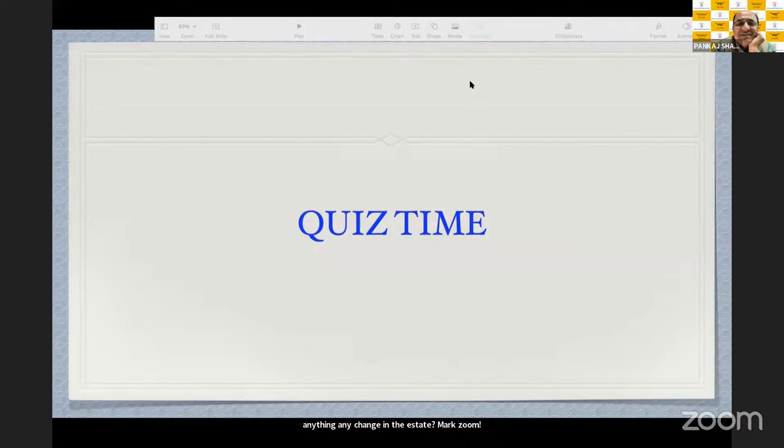This is a very easy question. Young persons usually have with-the-rule astigmatism, which changes to against-the-rule because of the pressure of the eyelids. Even if there was no astigmatism in young age, it still goes against the rule in old age. You do biometry for IOL; more than 60% will be against the rule in senile cataracts.